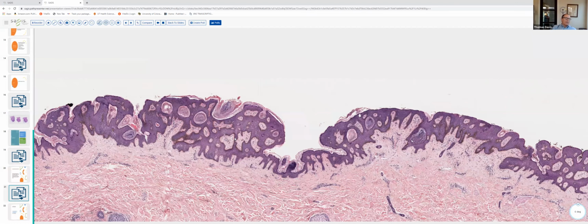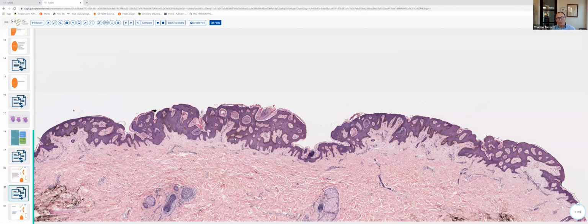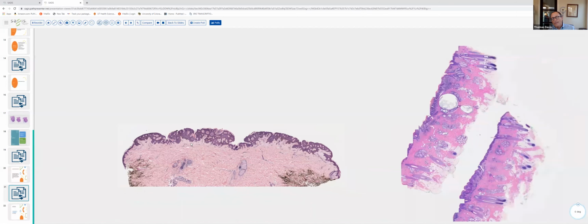Epidermal nevi look like seborrheic keratosis, with the exception of an inflammatory verrucous epidermal nevus. Generally, when I see an epidermal nevus biopsy, we see so many SEBs that I'm thinking SEB, and then you look down and either the clinical impression is epidermal nevus, or more often than not, it's from a 12-year-old or an 8-year-old, somebody who's way too young to have a seborrheic keratosis. So keep in mind, there's a lot of histologic overlap between epidermal nevi and seborrheic keratosis.